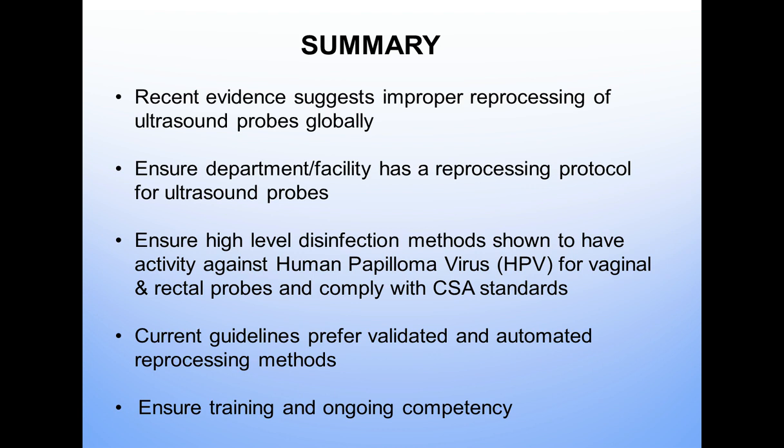So if you can purchase or recommend purchasing automated reprocessing methods, then you know that the procedures will all be followed accordingly, and you will hopefully have some data or printouts that you can utilize to ensure that you did meet those guidelines. So that's a very important point as well.